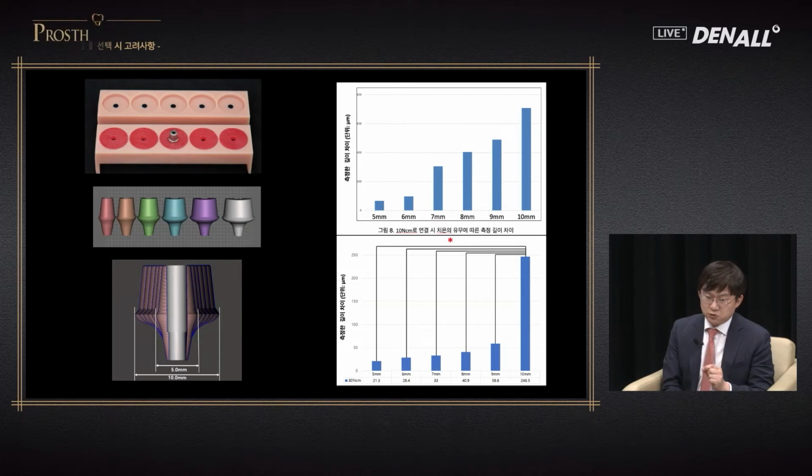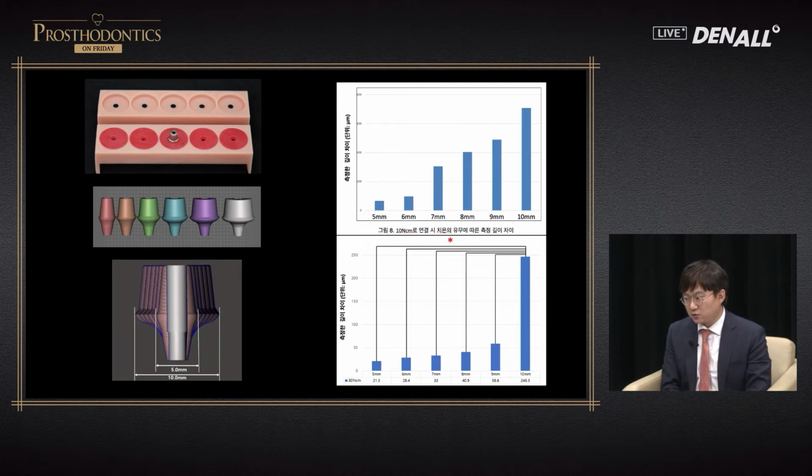With the screw type used in the posterior region, I was worried that with a screw type internal connection, implant sinking down under occlusion may occur. So I carefully checked the occlusion using silicone. The thickness has been measured for a long time, and I observed whether the shim stock comes out easily or not.